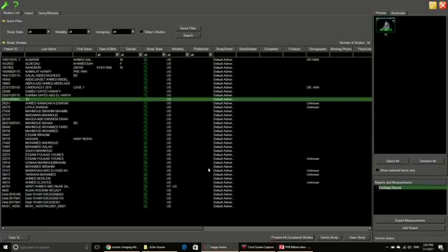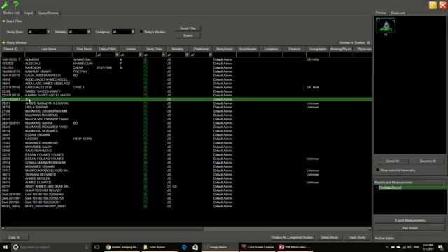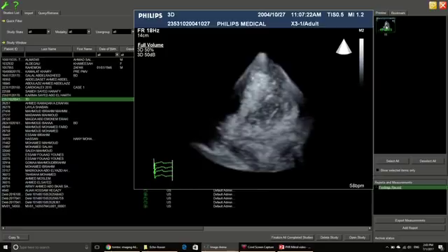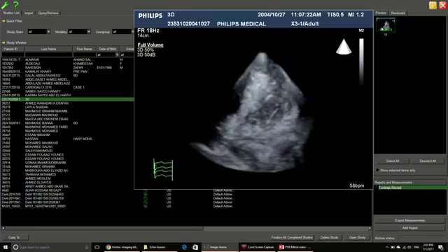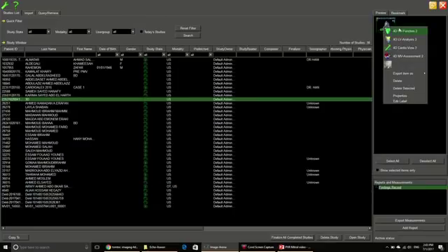This is the interface of the Tomtec software after you open the icon from your desktop or laptop. The list of patients will be listed here, and then I choose my particular patient in order to analyze. This 3D dataset will be displayed here. Once it is displayed, if I put the mouse over it even without clicking, it will display what is inside. Then right-click on that — it will give you the options or the tools by which you can work on this particular volume.